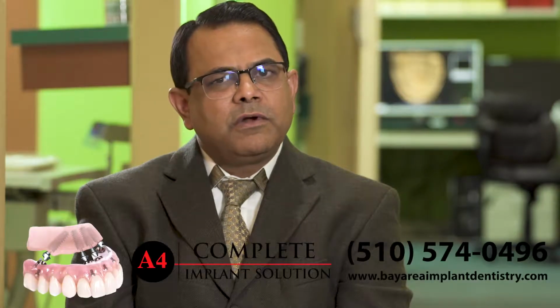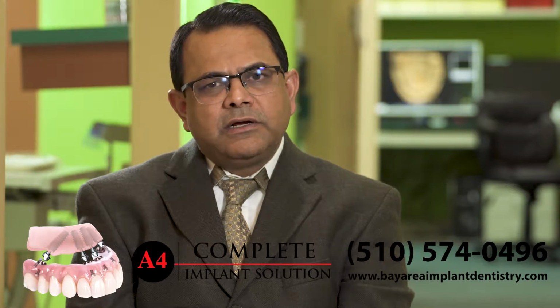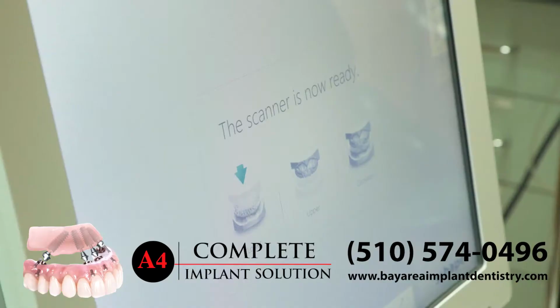In order to make implant prosthetics, you have to acquire the data. So you can take the data by traditional means by putting an impression material in the mouth, which patients can have a hard time dealing with.